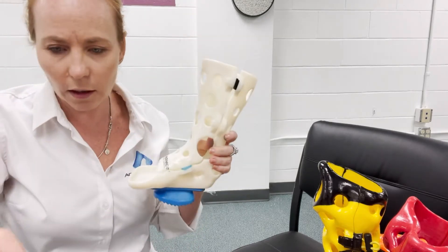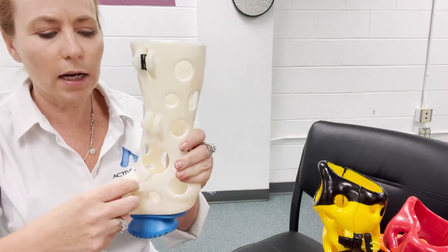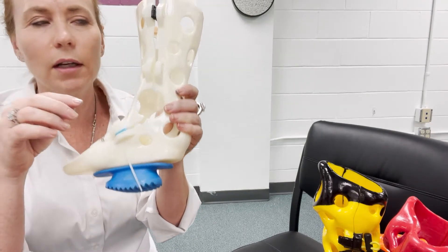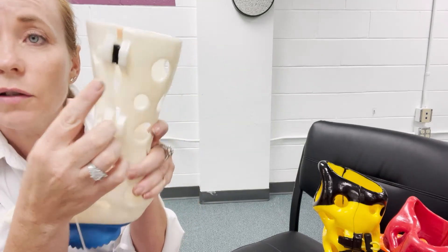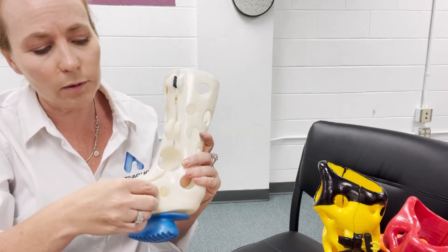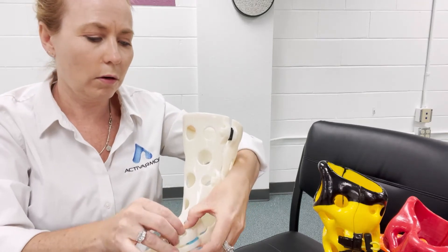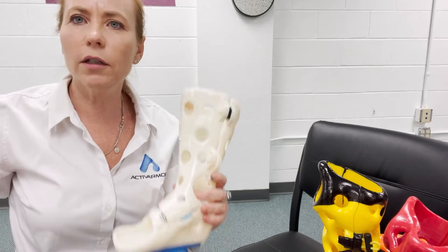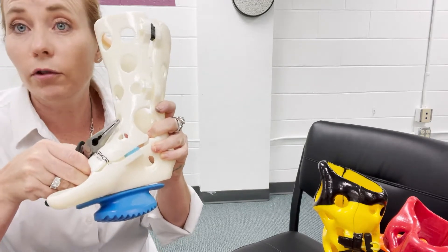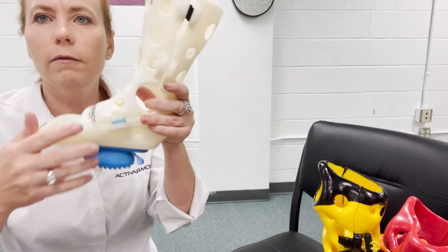You pop a little spacer in there, then take your zip tie and run it through the cast and the spacer. You can stack these spacers — this one has two in there — so you can stack as many as you want to make as little or as much space as you want anywhere in the cast. Run the zip tie through the spacer, back up through, and pop it through the hole. We also give you a needle-nose pliers to grab the end and pull and tighten it down if you need to. Then clip the end off with your clippers.